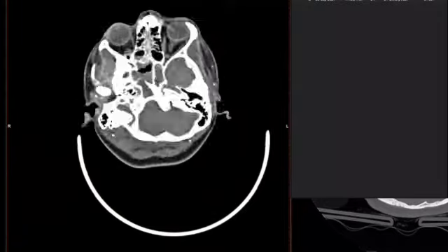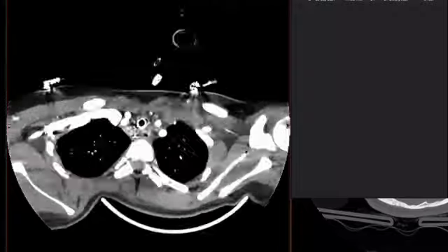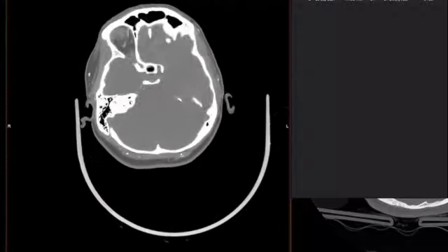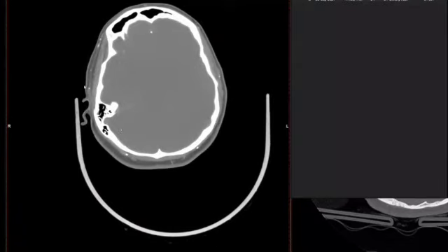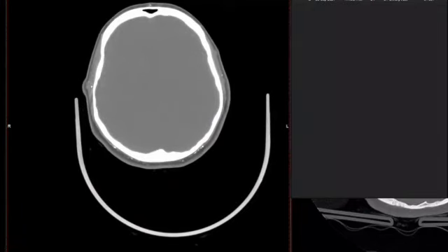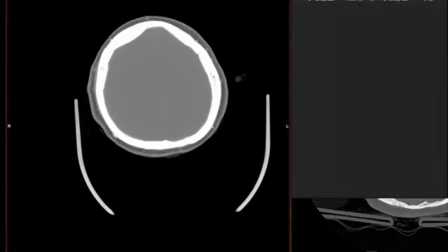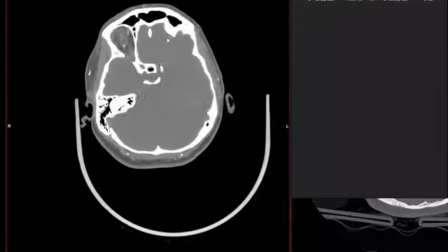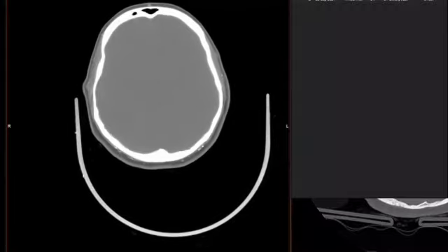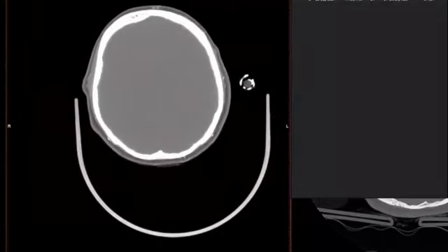We actually did her neck on the CTA because of the cervical injury, but I'm going to scroll through that. This is the 20-second study, and you can see beautifully these branches of the external carotid artery light up. From a technical point of view, this is good. We know contrast has gone in. It's interarterial, it's the right sort of phase, and it's up to the level of the brain. That's what we want from the 20-second study.